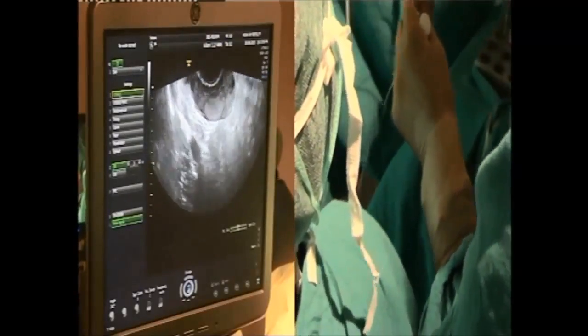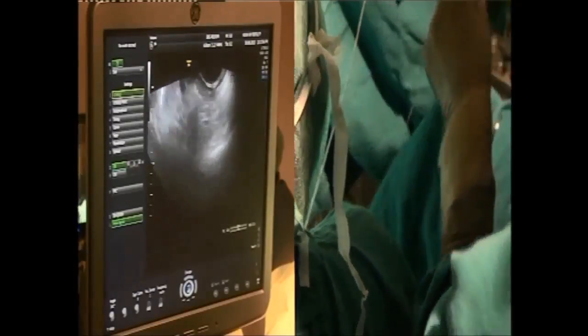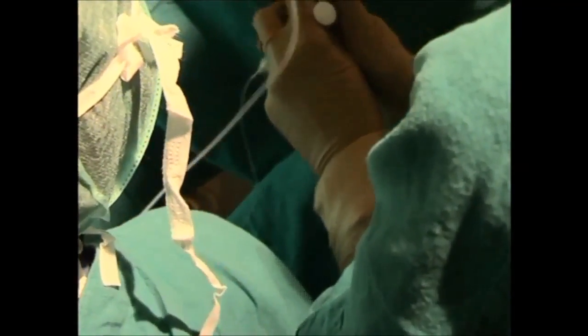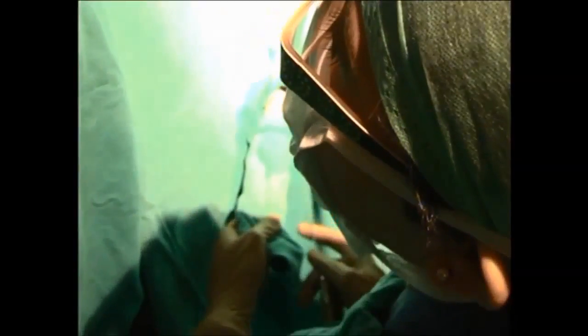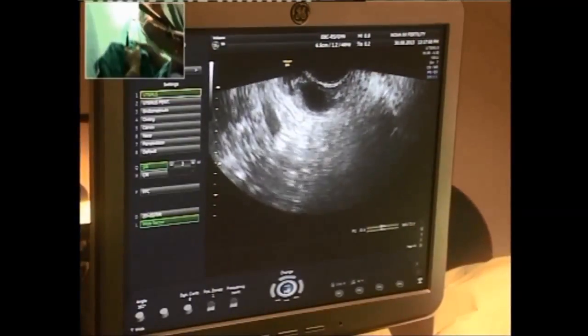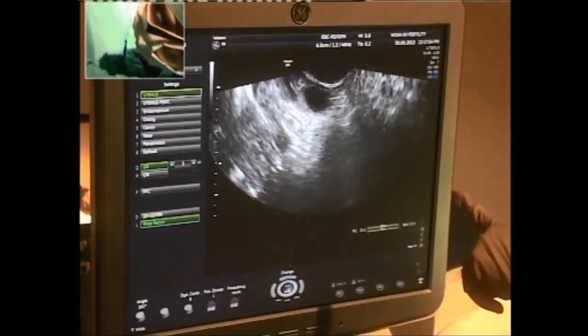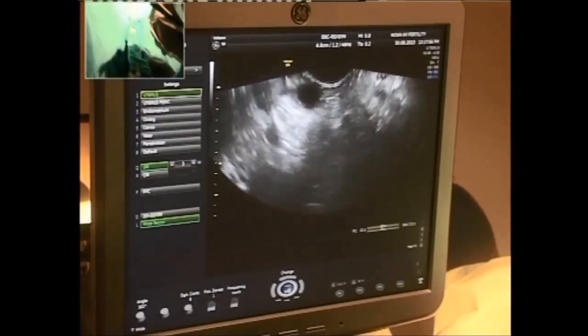The tube goes back again to the lab. I want to ask: what fluid are you using for flushing — Ringer's or some kind of media? No, it's media — flushing media. Can I have the view bigger please?